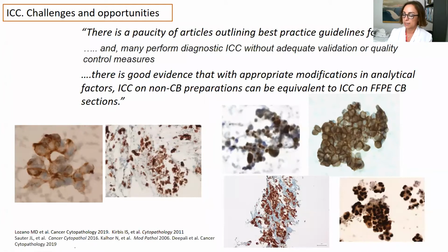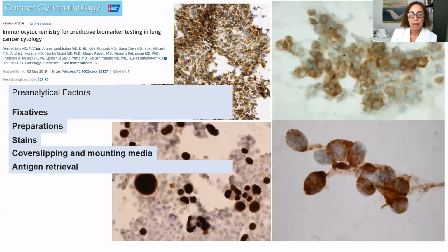And as in paraffin samples, there are some pre-analytical factors that have to be taken into account when we try to perform immunohistochemistry in cytological samples.